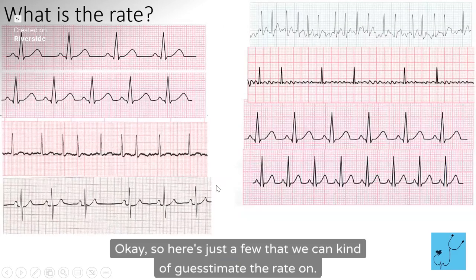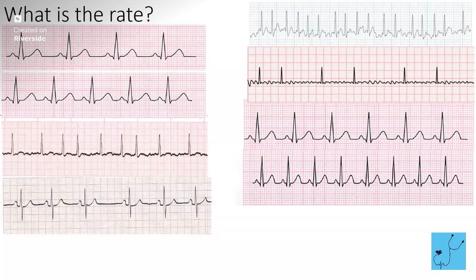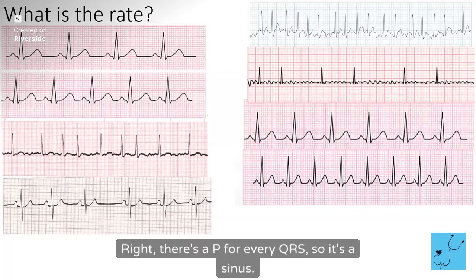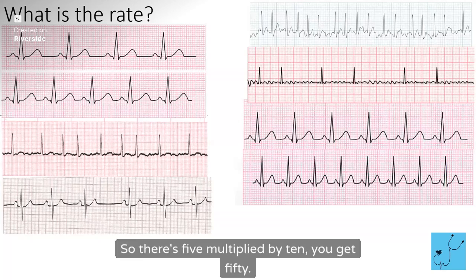Okay, so here are just a few that we can guesstimate the rate on. What do we think about this one? These are all 6-second strips. Yeah, so 40, right? We have 4 beats. They appear to be regular, multiply by 10. So sinus Brady. What makes it sinus? Right, there's a P for every QRS, so it's sinus, okay? What about this one? Sinus. Good, sinus Brady. So there's 5, multiplied by 10, you get 50.